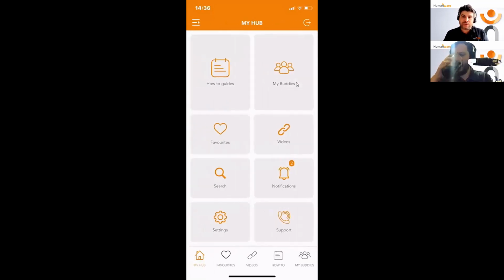And the notifications, which 3% of you today have received a notification to tell you about this webinar. This is really to keep you updated with what's happening at HumanWare. So maybe there's a new webinar that's approaching, maybe it's of interest to you, maybe it's new software that we're going to introduce. You'll be notified by the notification option. So if you haven't already got this application, or if you're using the app, maybe you need to update it if you haven't already done so to get some of these extra benefits.